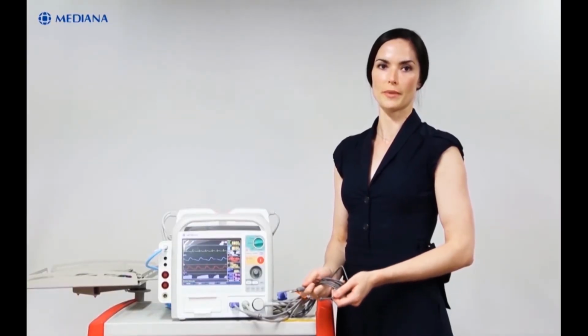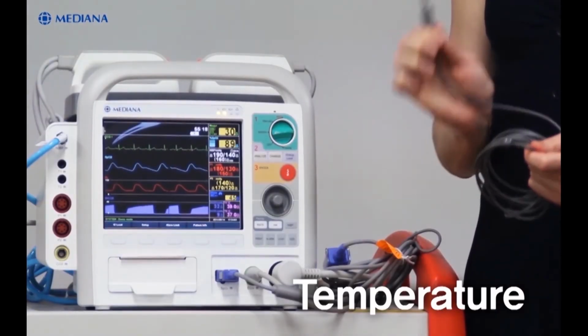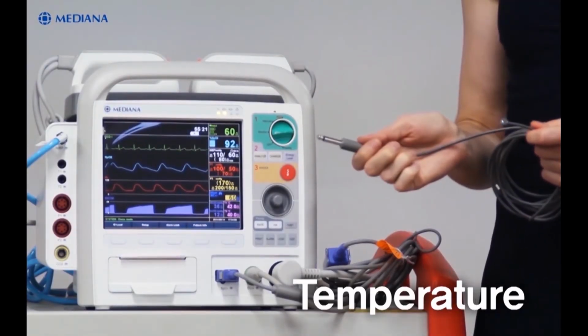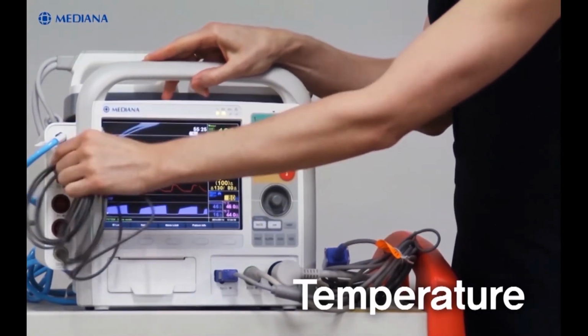For temperature measurement, we have a temperature probe, skin or rectal type. First, select the appropriate probes for the desired application, and then connect the temperature probes to the temperature connector on D500's side option case.